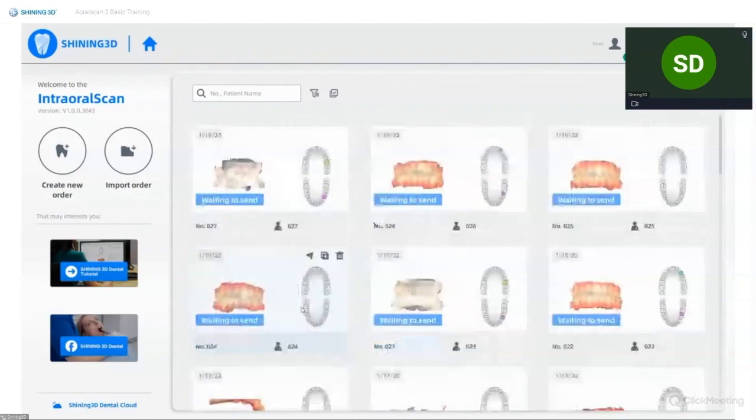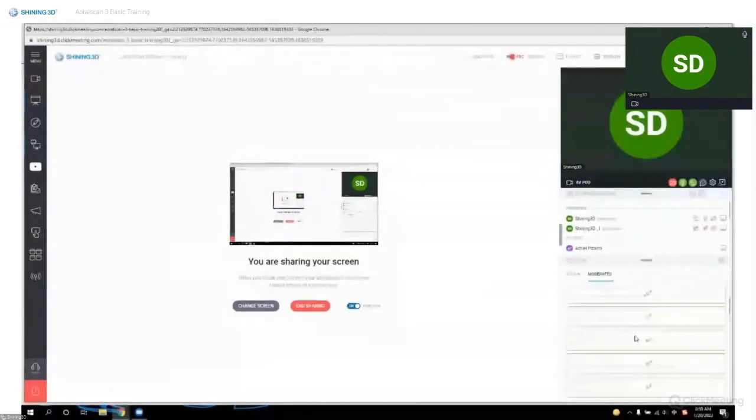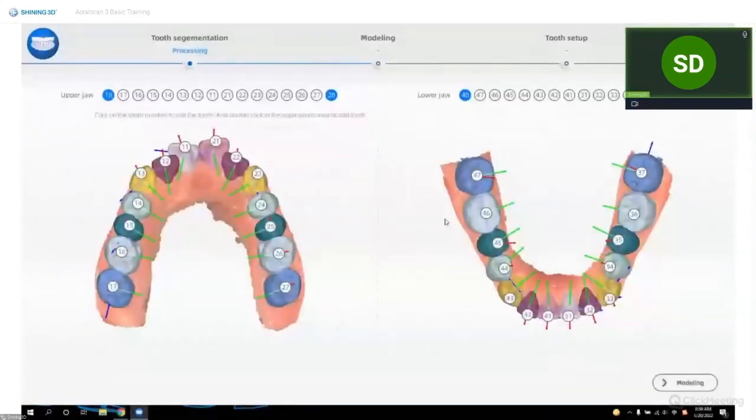Screen sharing from your end shows my network is not stable. Okay. I'm not sure if you guys see how to enter this simulation page, but I will just finish talking about this function and demonstrate again.